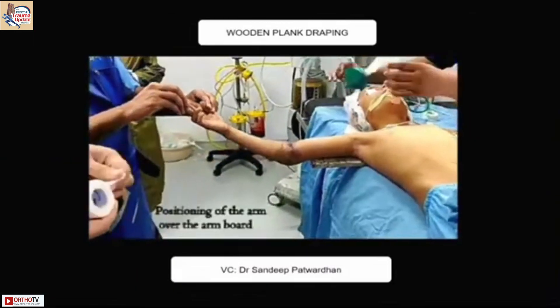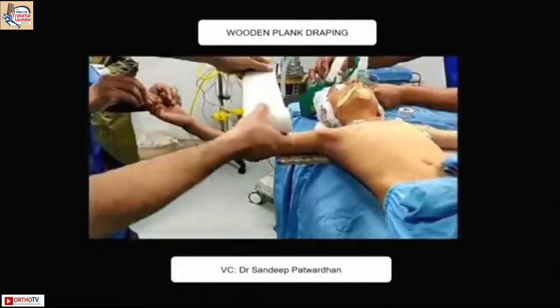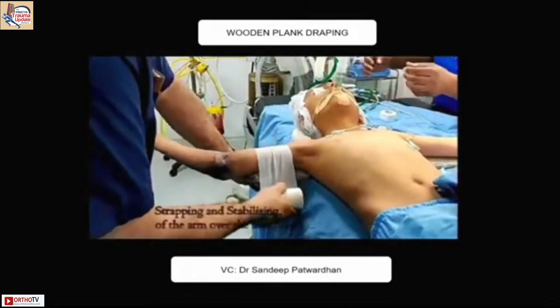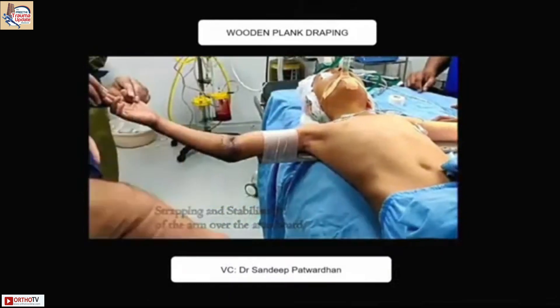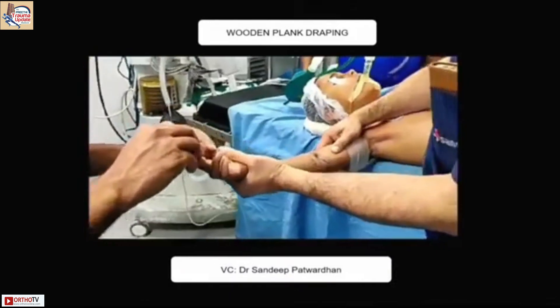This is a technique taught to us by Dr. Sandeep. He uses a wooden plank to stabilize the proximal fragment, and then distally you can manipulate without much need for traction or assistance.